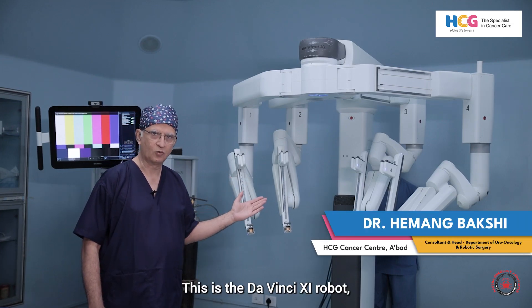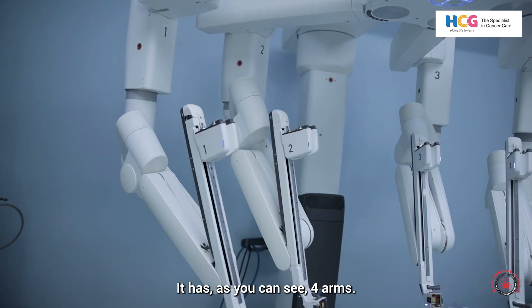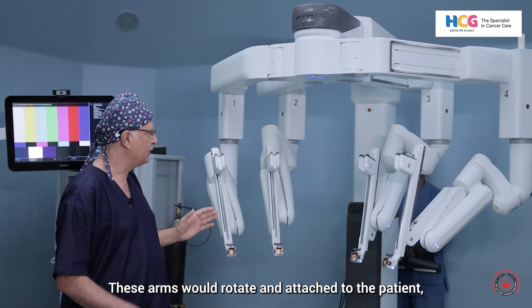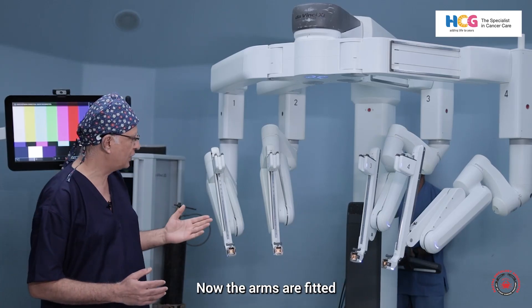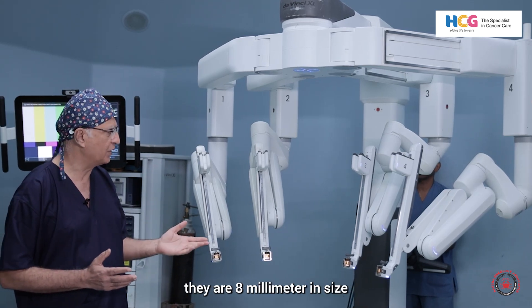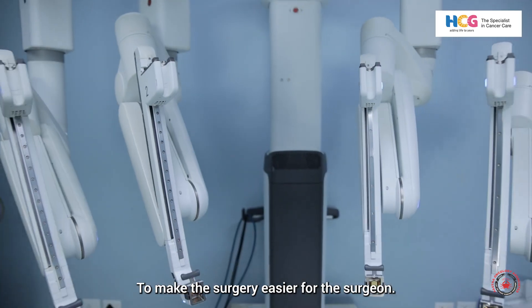This is the DaVinci XI robot, which is the latest robot available right now all over the world. It has, as you can see, four arms. These arms are attached to a central boom at the top, and these arms rotate and attach to the patient. The arms are fitted with four trocars, or ports as we call them. They are eight millimeters in size and can rotate in two directions to make the surgery easier for the surgeon.